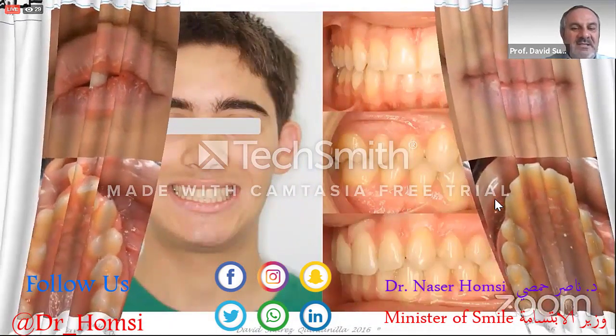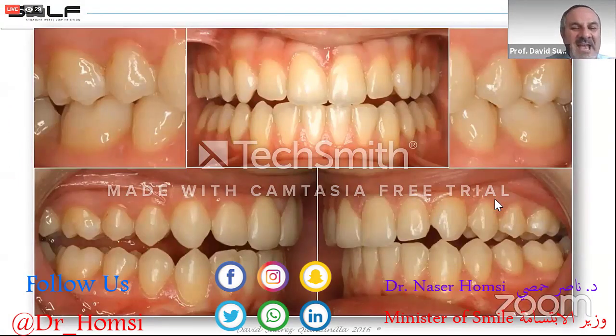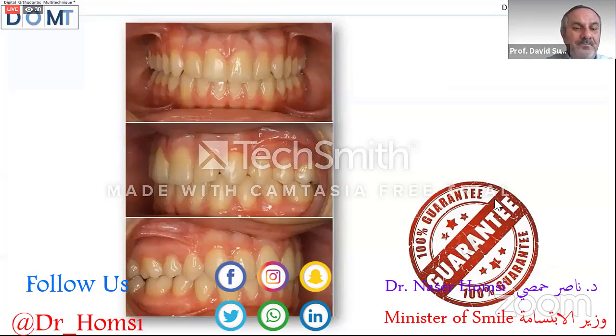This is the patient, and you can see the patient 3 years after the treatment with a very stable occlusion, a very nice occlusion, very good engagement and very good dynamic occlusion. This is not 100% stability, okay? Because in many cases it's not possible to stimulate the growth of the alveolar bone or the mandible. But in our hands, the best result to treat a patient with mandibular class 2 is the combination of the use of functional appliance and the fixed appliance. The ideal in the future is the digital functional appliance. This is the ideal for the future.